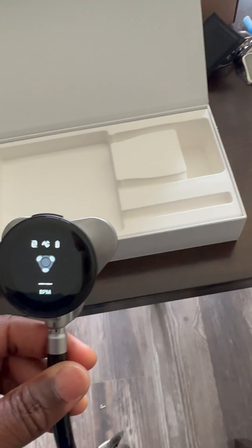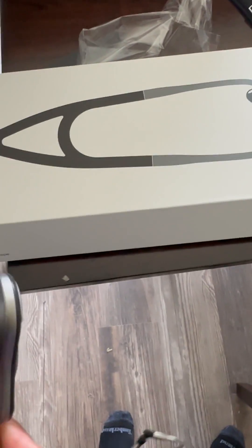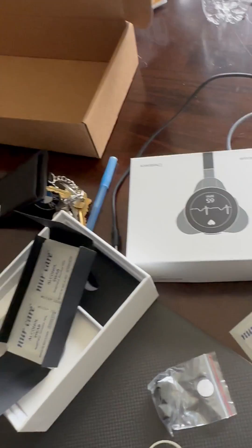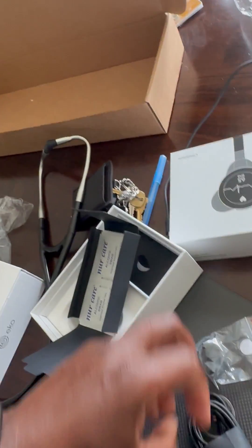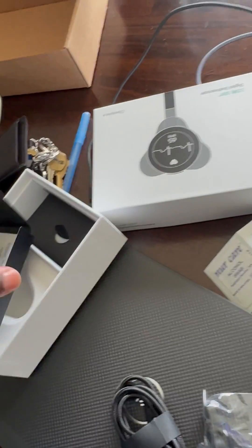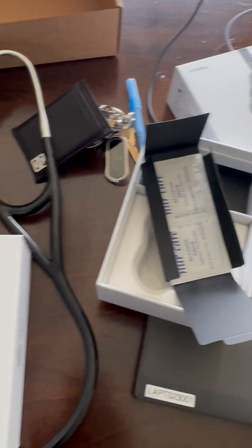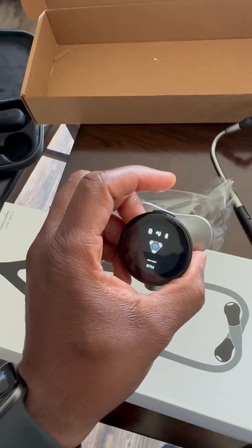I received my Echo today, so I unboxed it already and uploaded a couple of videos on there. In the box you have the earpiece and the frame comes in here. You also have an extra USB charger, an extra small earpiece, some cotton swabs, and alcohol swabs.